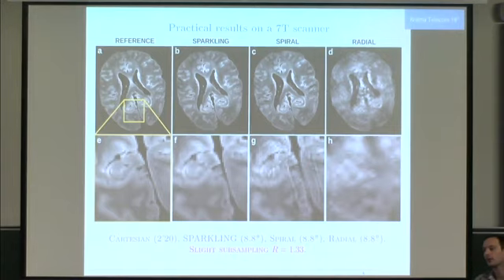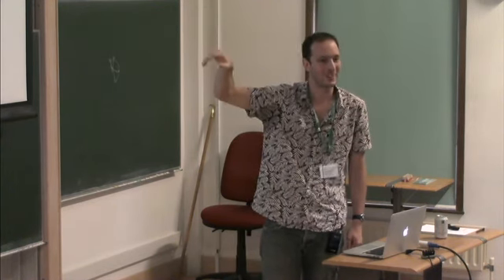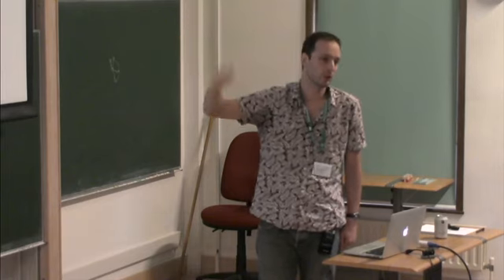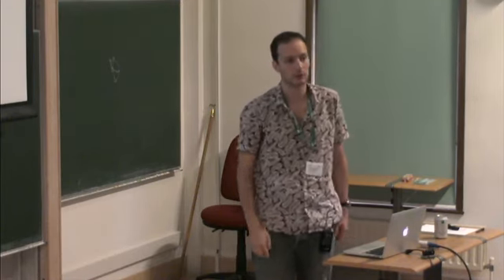How does this scale with dimensions? Suppose you want to solve it in like 5D or 10D. So with the semi-discrete optimal transportation, it would not scale because computing the power diagrams scales, I don't remember exactly, but it depends on the dimension, and the complexity is the square of the number of particles in 3D, for instance. So it does not scale. Like here, it's extremely complicated to make those simulations. We need multi-core programming, many things, and we want to reach like 1 million particles. And so when you square this, it's just intractable. But for the convolution distance, it's just linear in the dimension, so it would work.